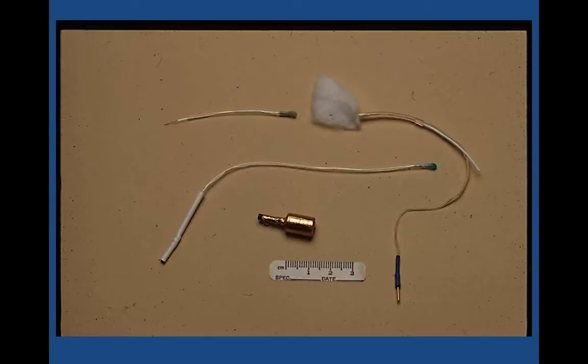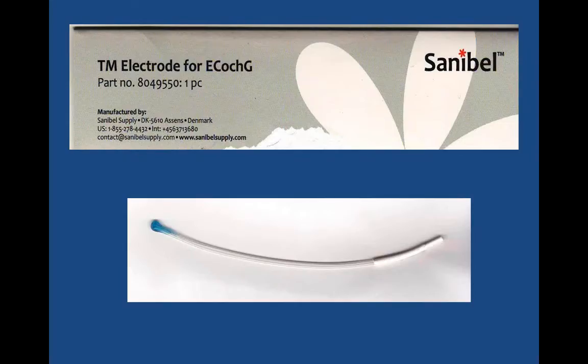And audiologists in particular wouldn't be able to do this approach without the assistance of a physician to place and remove the electrode, and that means a two-person team, which usually isn't economically feasible. So all of our recordings today, and all the ones I'm going to talk about, are done extratympanically and primarily from the tympanic membrane.